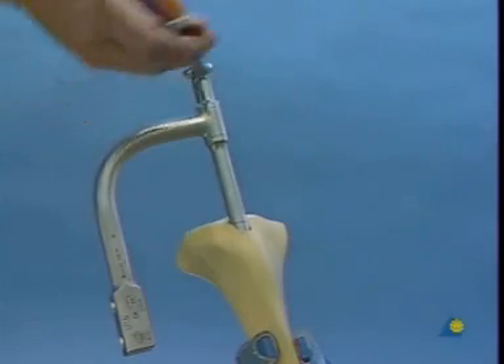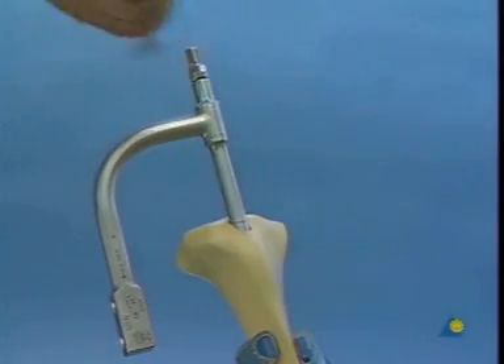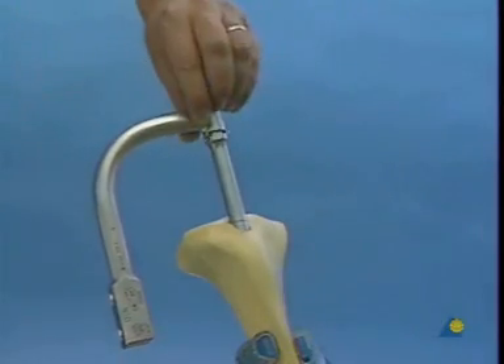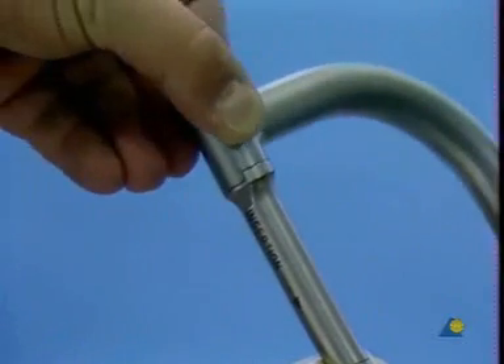If the nail is to be locked proximally, the insertion handle must be swung in a medial direction. The slot and groove of the insertion handle and the coupling block must connect properly.